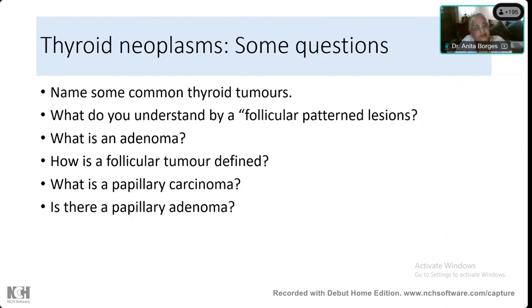Okay. Come on, Mukta, what is a papillary tumor then? What is a papillary carcinoma? It has to be predominantly papillary, is it? Ma'am, more than 1% papillary pattern. Oh my goodness, predominant. I see. All right, and nuclear changes are also seen.